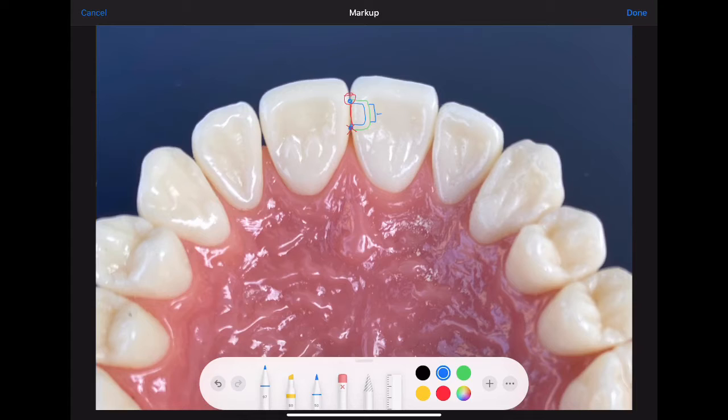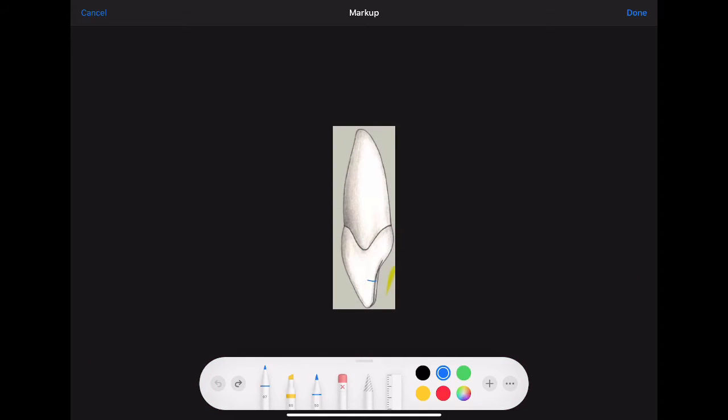Your preparation will have an incisogingival dimension of 1.5 to 2 millimeters, and the axial wall will be 1 to 1.1 millimeters. Remember, these are ideal sizes for your preclinical preparation. However, on a patient, the extent of the caries will determine the preparation size. Proximally, our preparation will have rounded line angles. And if we visualize where our facial contact is, we can see that we just minimally broke it.